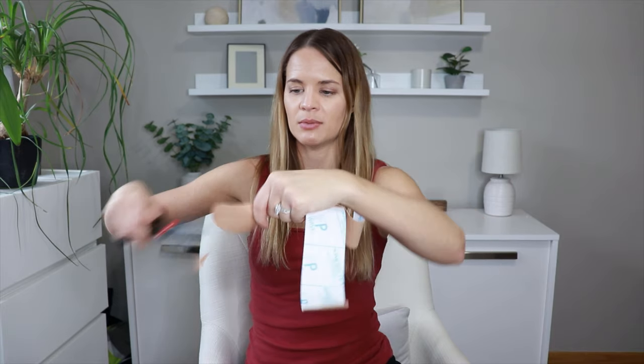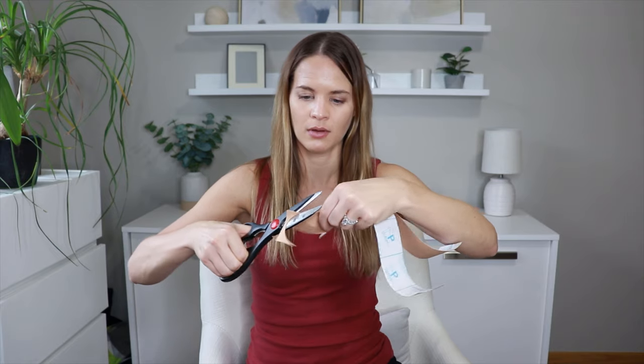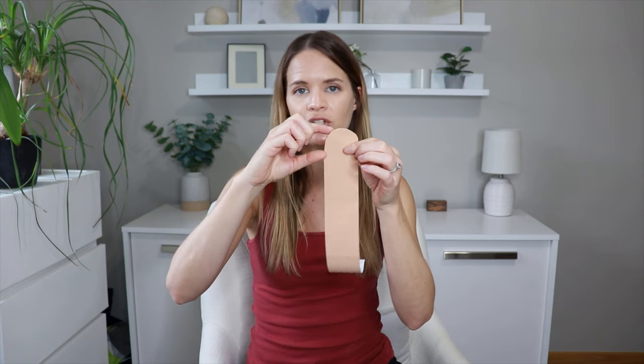From there we want to trim one edge — we want the edges rounded so that they stay put longer and the ends don't peel up. So we'll trim around the corners to make the edge more rounded, then do the same thing on the other side. From there we're going to cut this strip into four equal smaller strips, leaving about one to two inches at the top as the anchor. We don't want to cut that side at all, but then we cut four equal strips from there.